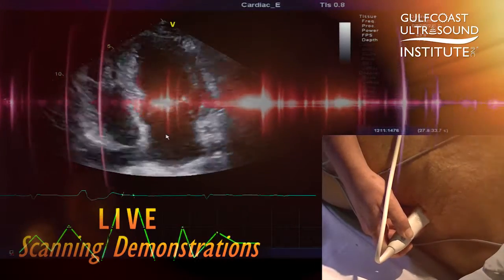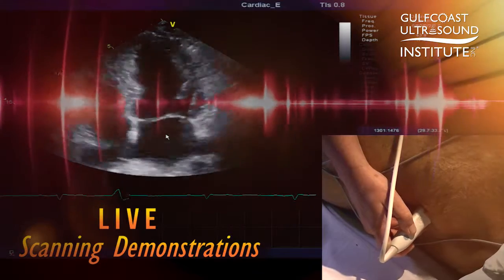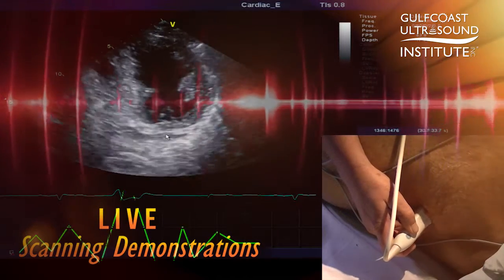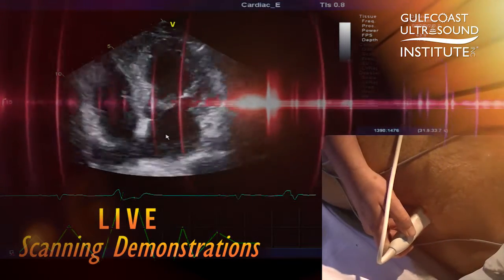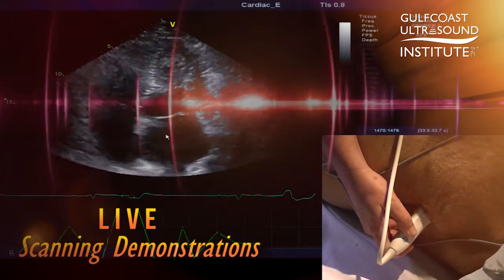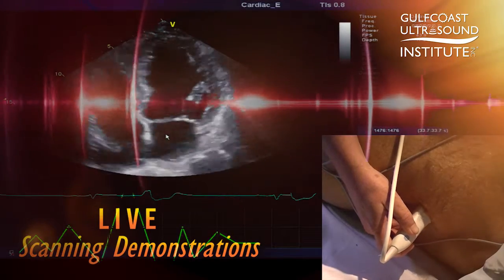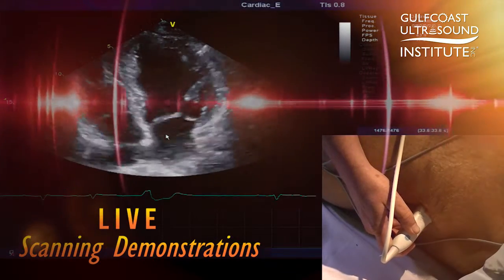When I'm trying to get in the middle of the heart, I say, okay, that's coronary sinus, that's aorta, and then whatever's in between — that's my fourth chamber view.